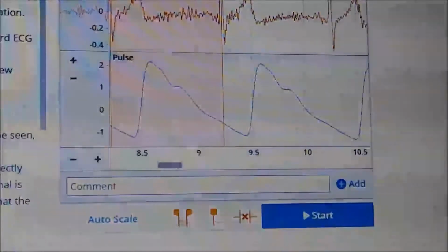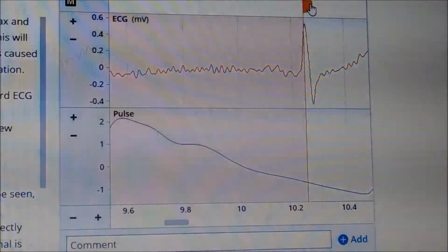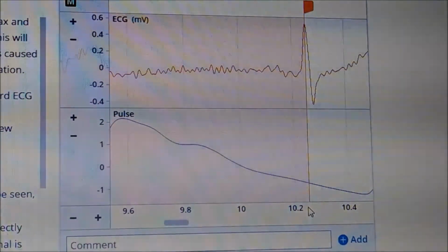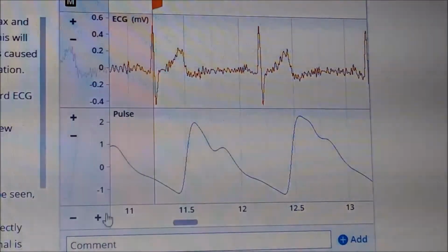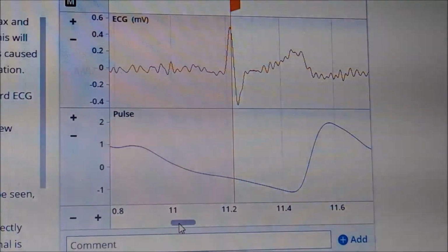So now I'm going to be using the ECG signal to determine the average heart rate. What I'm doing is setting the markers from R peak to the adjacent R peak and measuring the duration. Sometimes, to get quite accurate, you're going to need to adjust the scale for the time. As you can see, I've been doing that and scrolling back and forth. But essentially, we're going to measure 3 R peaks in a row and take the average, just like we did with the pulse meter. We're going to look at the math now.